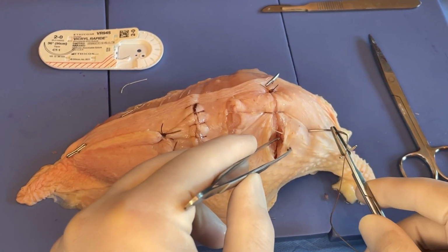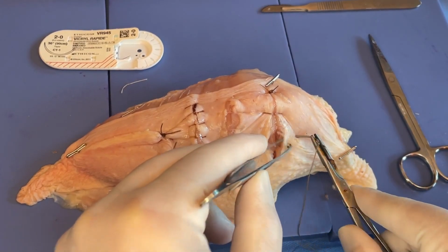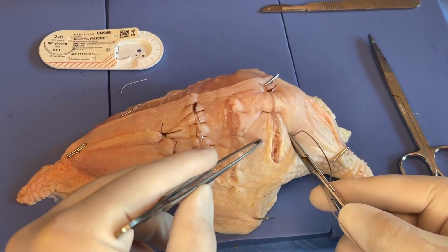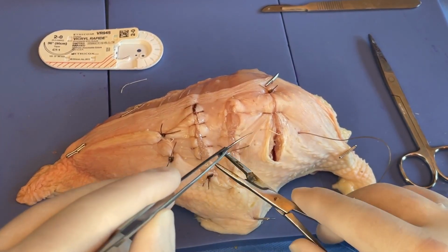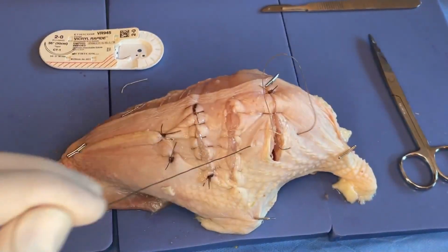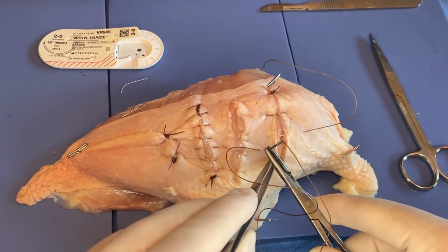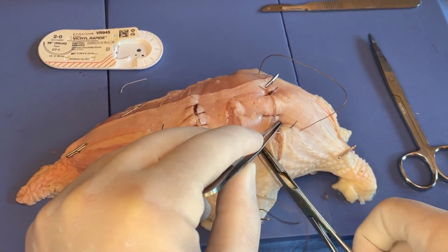A better way to demonstrate that perhaps is we come through the bottom part of tissue here and out. And then we're going to kind of backhand this and pass back. So now we go closer to the edge of tissue here and come out a little bit closer there.